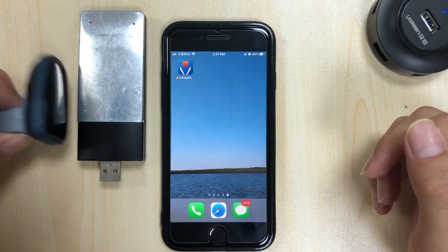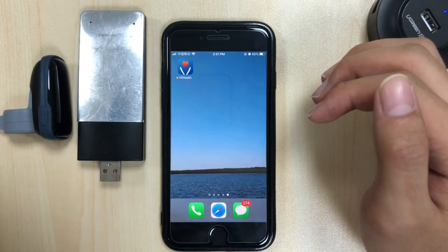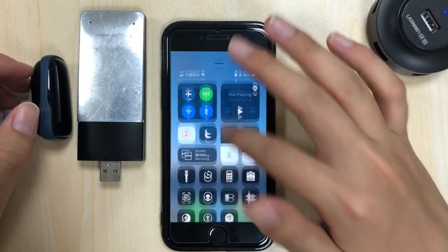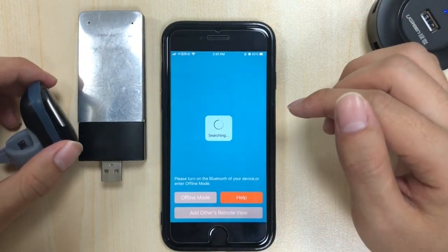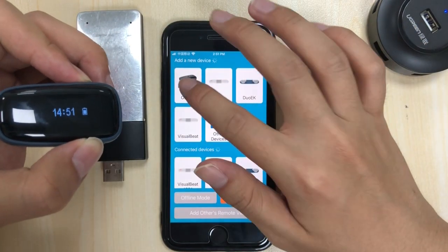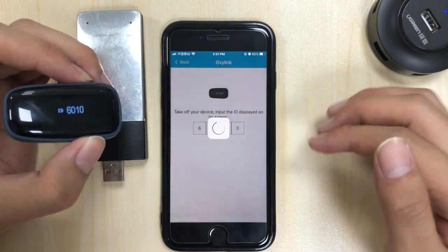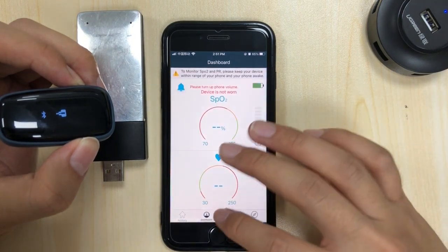We have the OSLINK and the Remote USB. Let's set them up — turn on Bluetooth and run the V-health app. When it's searching for devices, turn on the device. It has been found. Type in 601 now. Okay, it's all good.